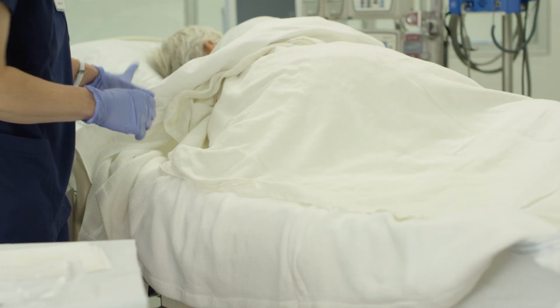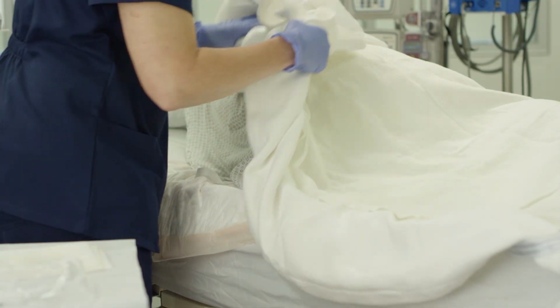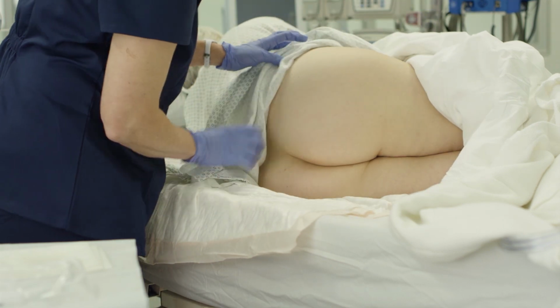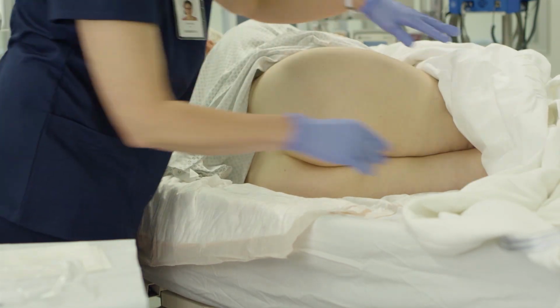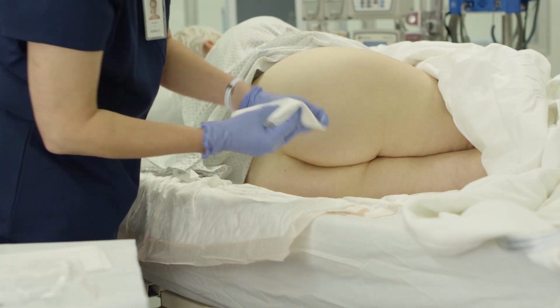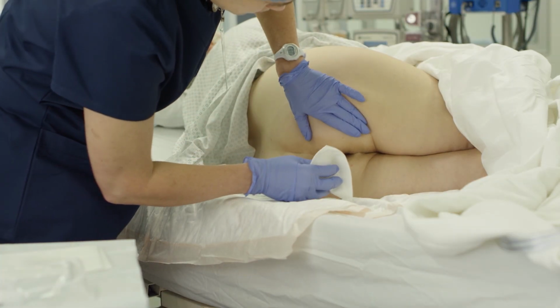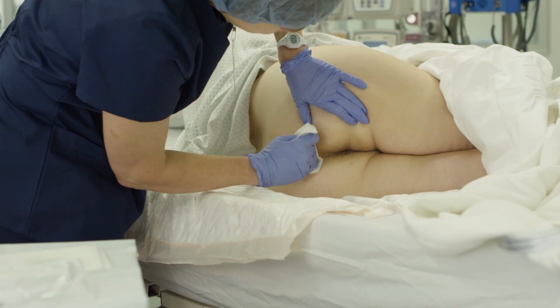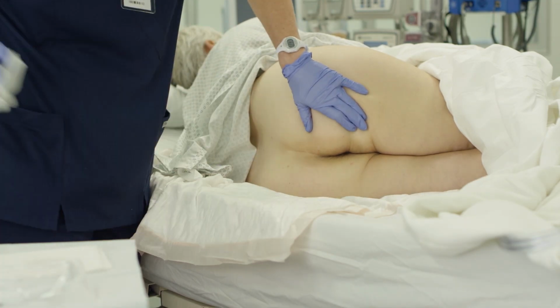Next, position the patient on their side. Expose the skin adequately for cleansing, but try to keep the patient covered as much as possible for warmth and dignity. If there is a lot of liquid stool, isolate it with either the soiled brief or the underpad before cleansing.